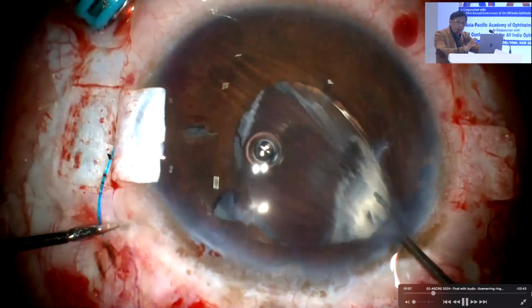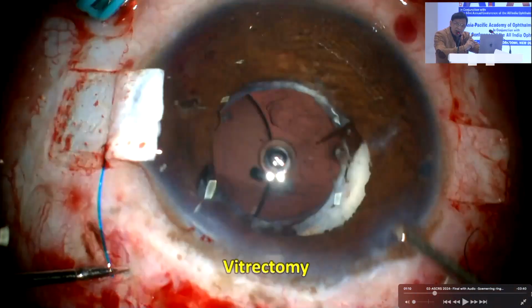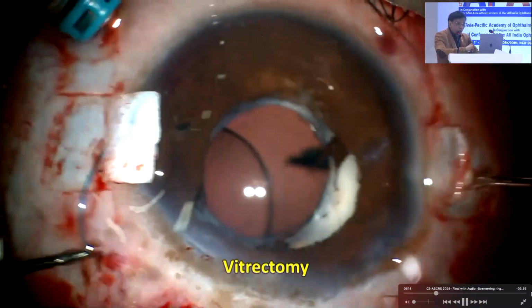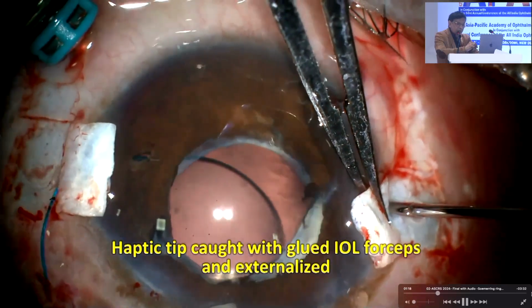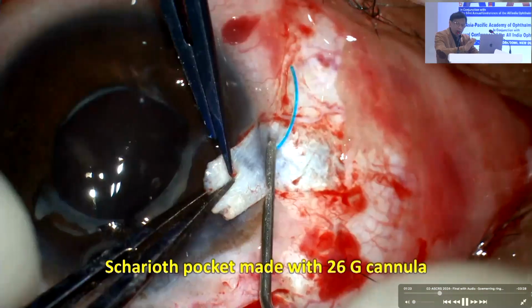Whenever you have a Soemmering ring where there is no capsule, remember, I need a scaffold there. But where will I put the scaffold? Unless you do a Yamane or a glued IOL, you can't do it, because you have to go behind the Soemmering ring. So now I'm doing the second haptic. Once I catch my second haptic, look at the tip, catch the tip and bring it out. So this is the glued IOL scaffold.